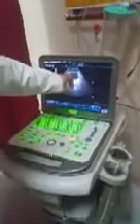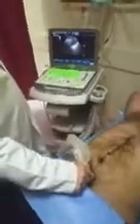As you see from the image, I show my patient's bladder in a rectangular transverse fashion, and when I change my probe position towards the patient's head, I see the bladder in the longitudinal view, to see the periphery at the posterior area of the bladder. Please place the fourth image of the abdominal scan.